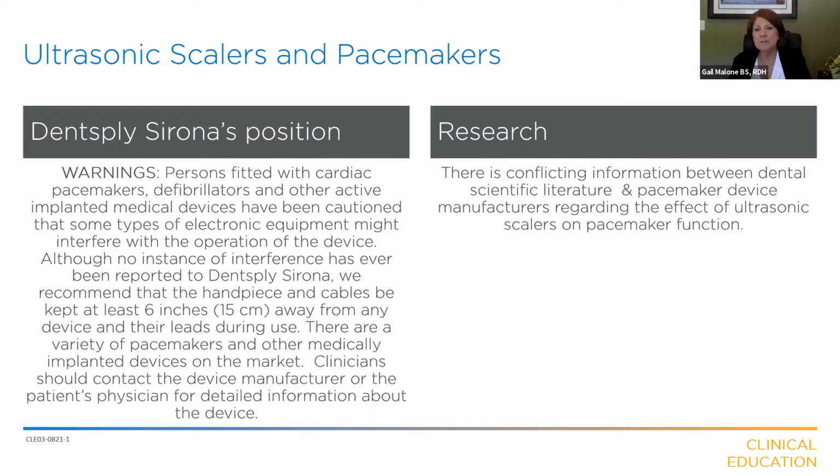So this is the $1 million question. What about using ultrasonic devices or scalers to treat patients who are fitted with implanted electronic devices, things like pacemakers, defibrillators, and other types of electronic devices? As you can see in the slide, there really is no clear consensus in the literature. There's actually conflicting information between dental scientific literature and pacemaker device manufacturers.